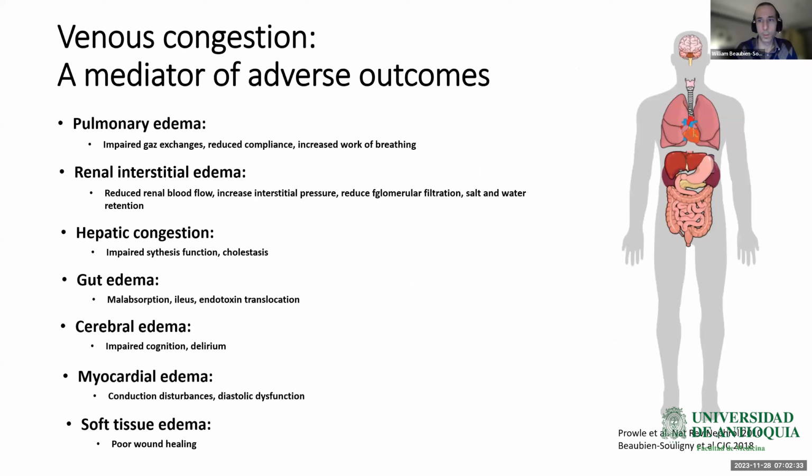The first prospective cohort study we did included 115 cardiac surgery patients and was looking at portal vein Doppler. The main objective of this first study was to describe the prevalence of abnormal portal vein Doppler and report associated factors, including hemodynamic and echocardiographic parameters. Portal vein Doppler was performed before and after surgery using transthoracic echo, and in the operating room using transesophageal echo.